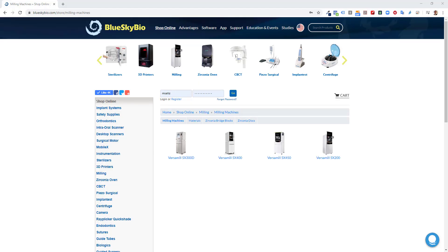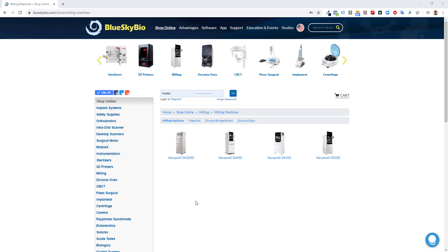BlueSky Bio distributes a line of VersaMill milling machines. You can see them by clicking on milling in the horizontal slider. This functionality works with other milling machines as well, and we're going to take a look at the capabilities and different customization options as we go through the process.